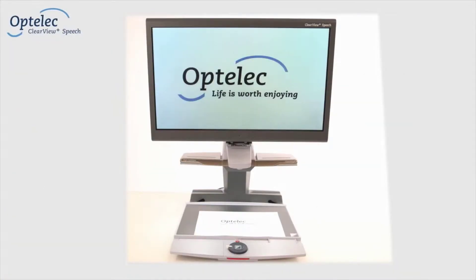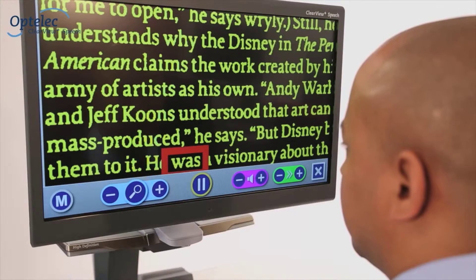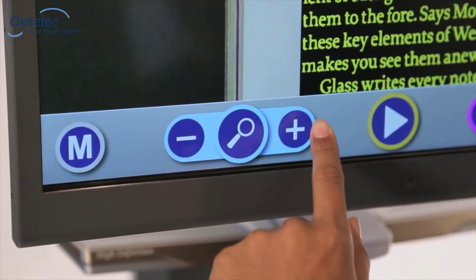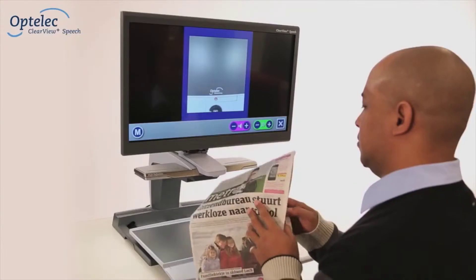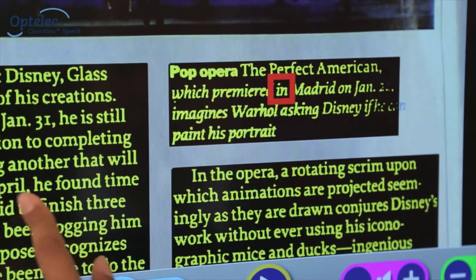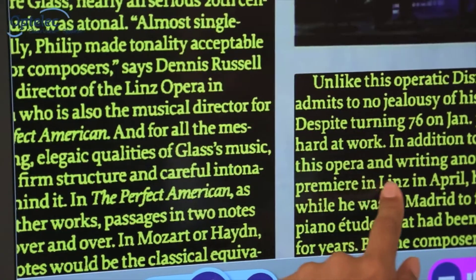The Optala Clearview Plus Speech is an innovative and unique module for any existing Clearview Plus desktop video magnifier. It allows you to view, increase the size of, and listen to documents. The Clearview Plus Speech allows you to read and listen to your newspapers, letters, and magazines with an integrated touch screen and instant point-and-read technology.